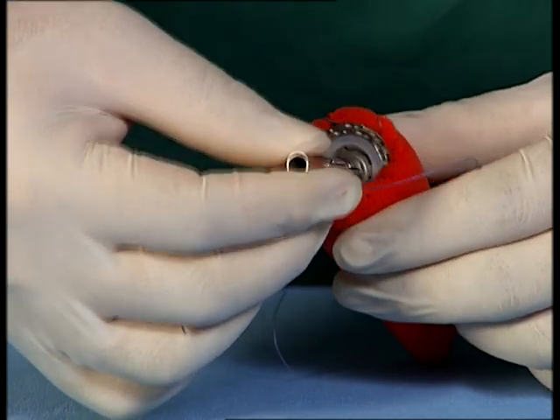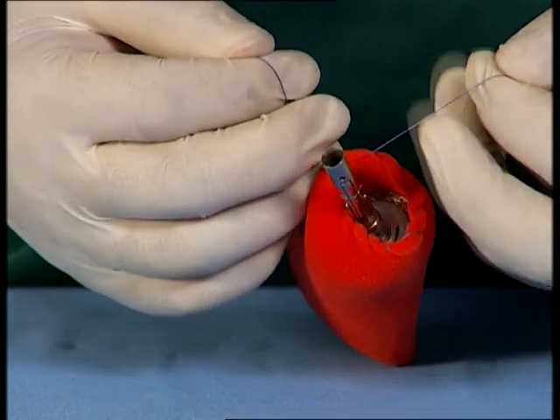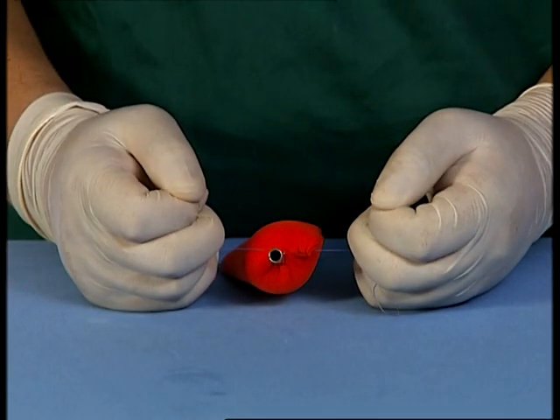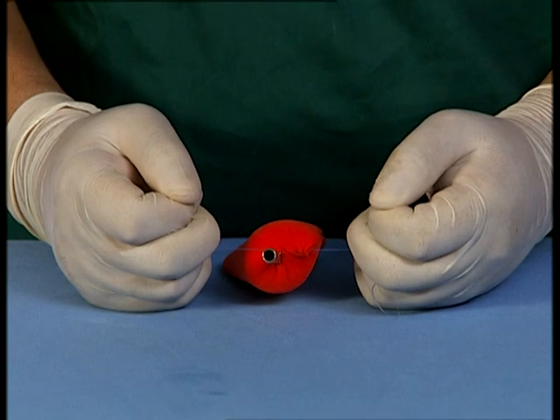Insert the detachable anvil assembly into the lumen and secure the purse string securely on the anvil shaft within the purse string notch. It is important to ensure that the purse string sutures are tied snugly against the anvil shaft at the appropriate location.